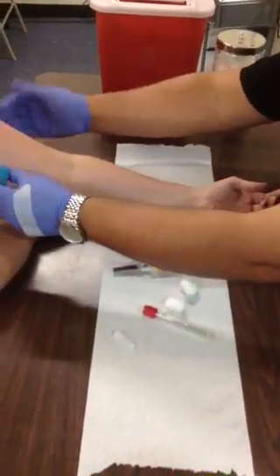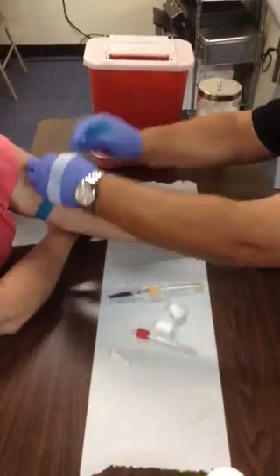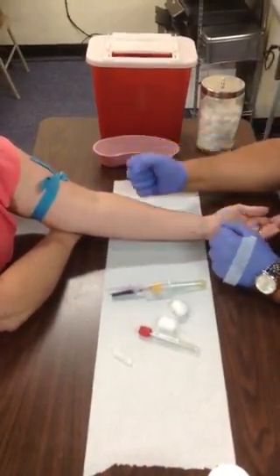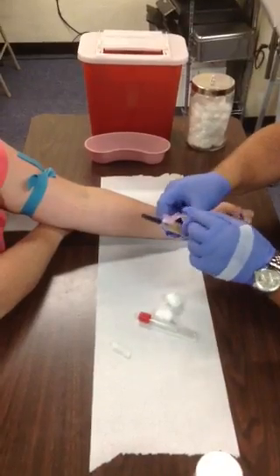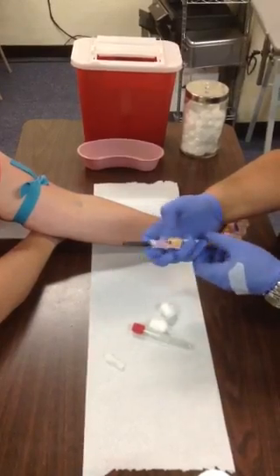Now that it's been 30 seconds, have the patient come forward just a little bit. Place the tourniquet three to four inches above the puncture site — remember not to let the tourniquet touch your puncture site. Have the patient keep the elbow straight and make a tight fist. Stand up, pull the safety device back, and then simply loosen that cap.